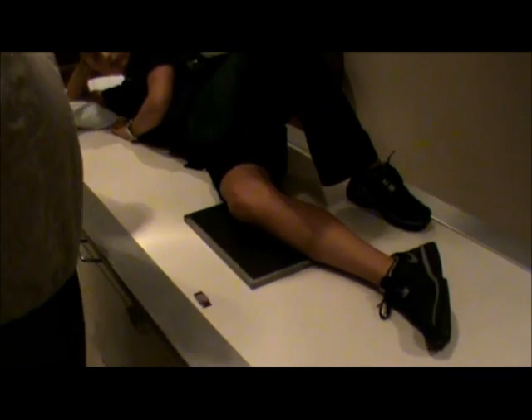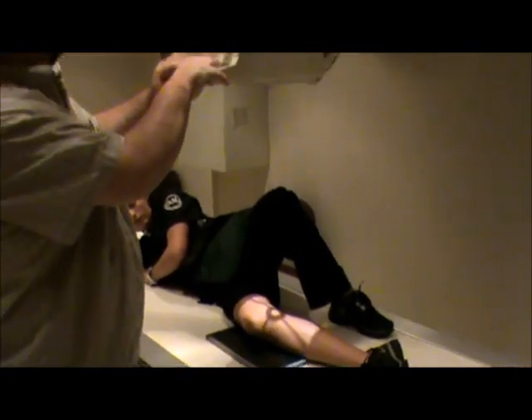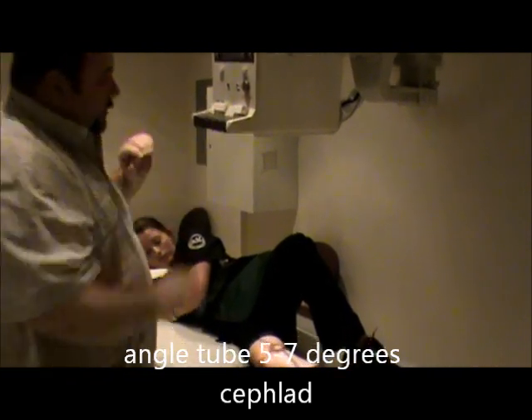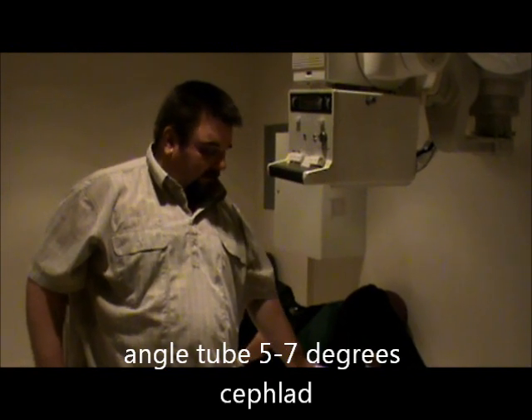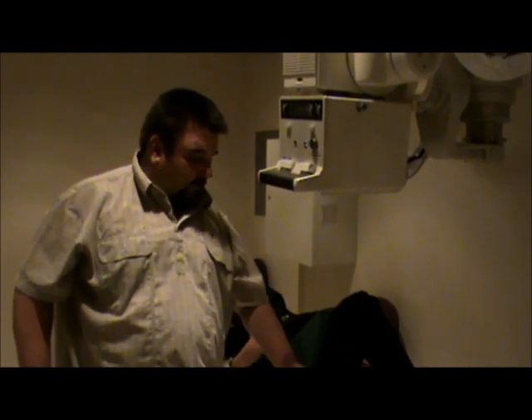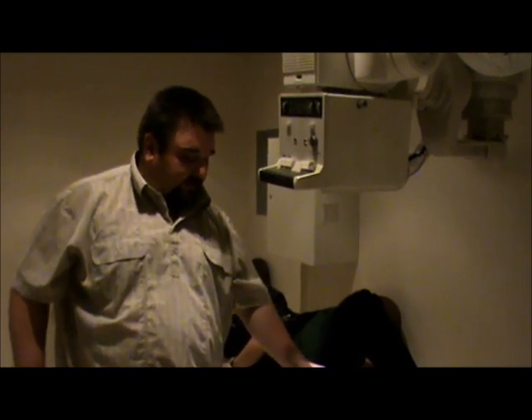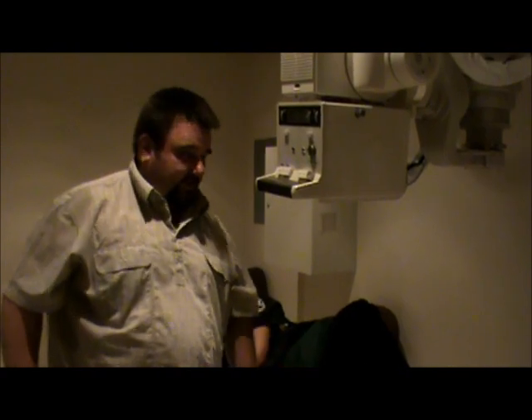We are going to angle on this — angle the tube five to seven degrees. The reason we want to do that is the medial epicondyle is longer, so by angling this we are actually going to superimpose the condyles. It does open up the joint space anteriorly and posteriorly, but it is obstructed in the middle because of the eminence.